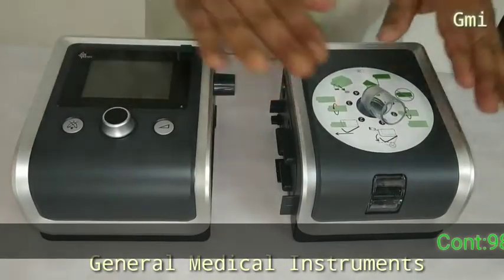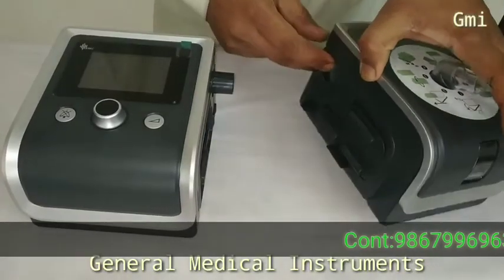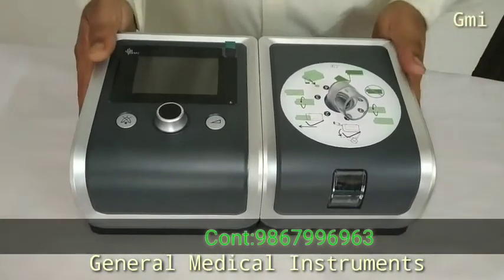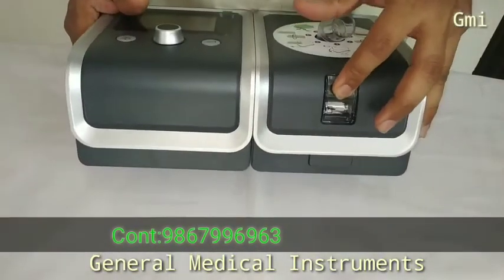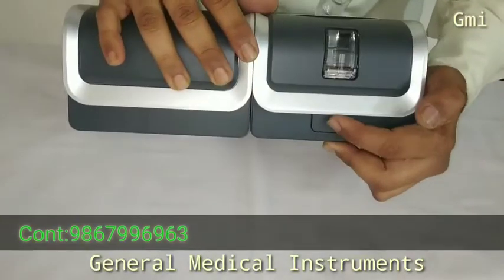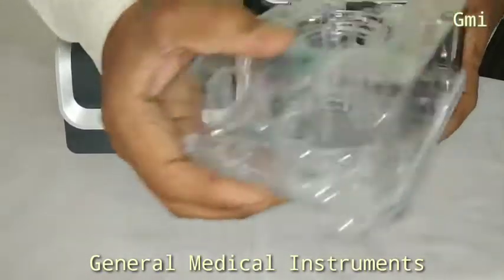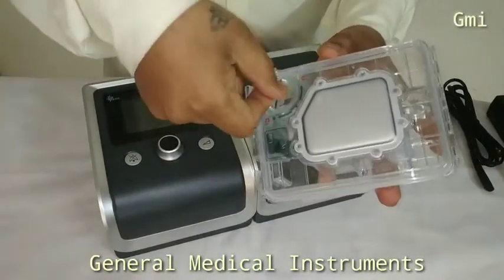This is BiPAP. This is Humidifier. Connecting Humidifier. Water Level Window. Ejecting Humidifier. Water Filling Port.